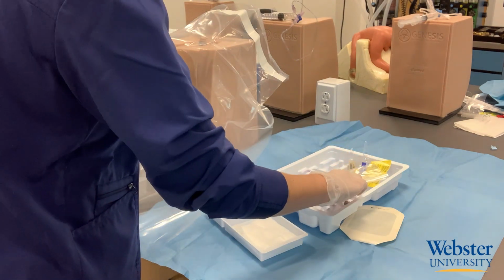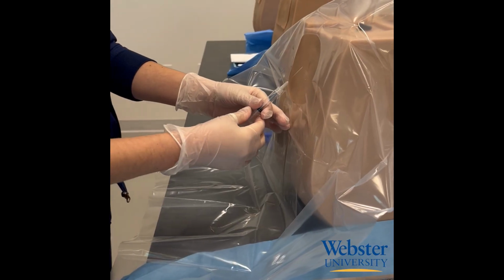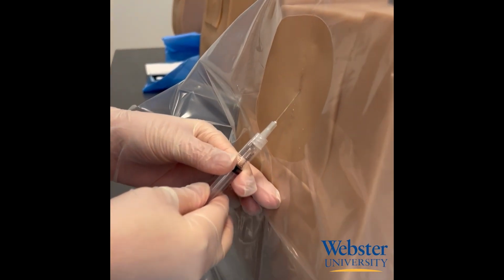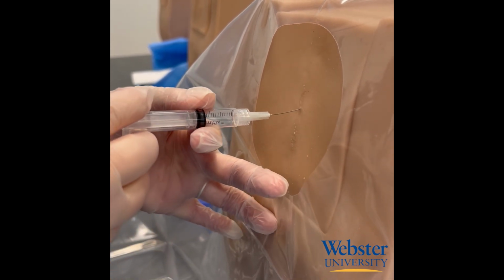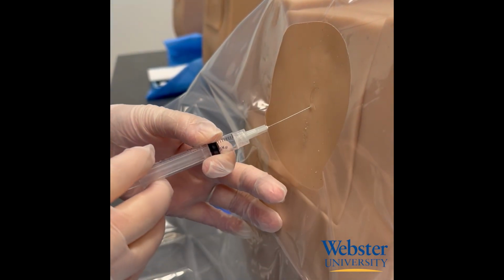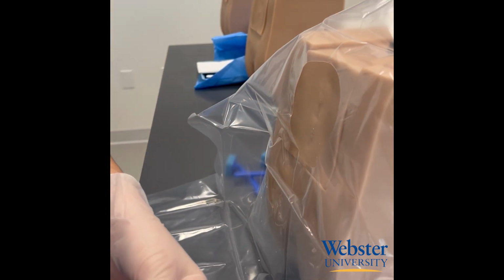Next, you want to inject the 1% lidocaine to numb the skin. While injecting lidocaine, use the needle to try to find the path and angle needed to get through the spinous processes. If you feel bone pretty shallow to the skin with this needle, try a different angle. Make a mental note of this angle because this is how you will want to introduce the epidural needle.